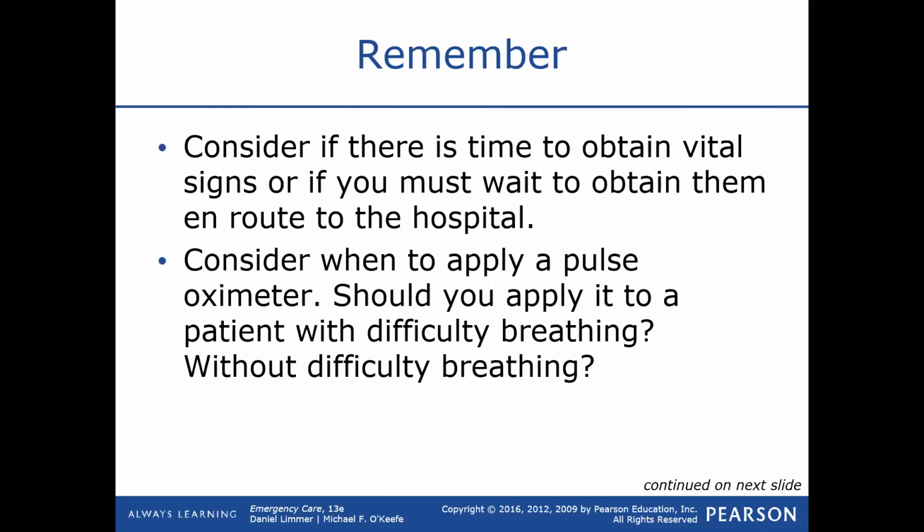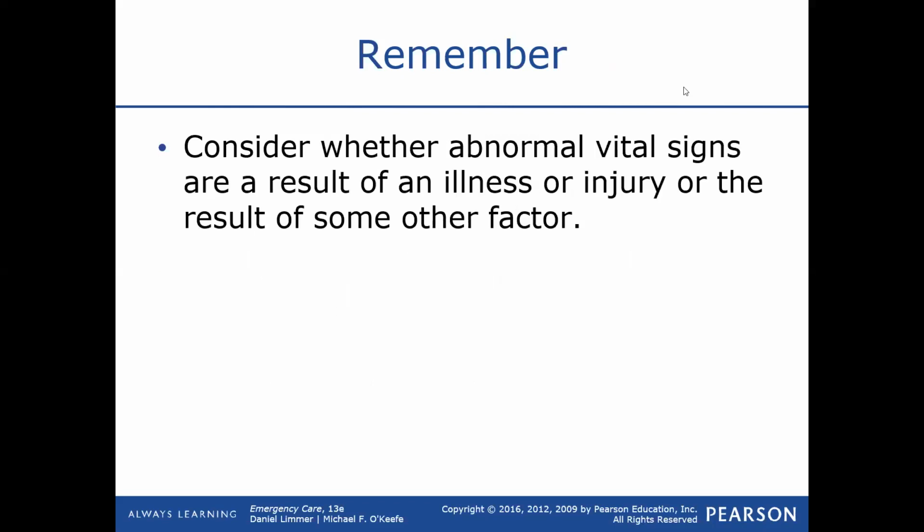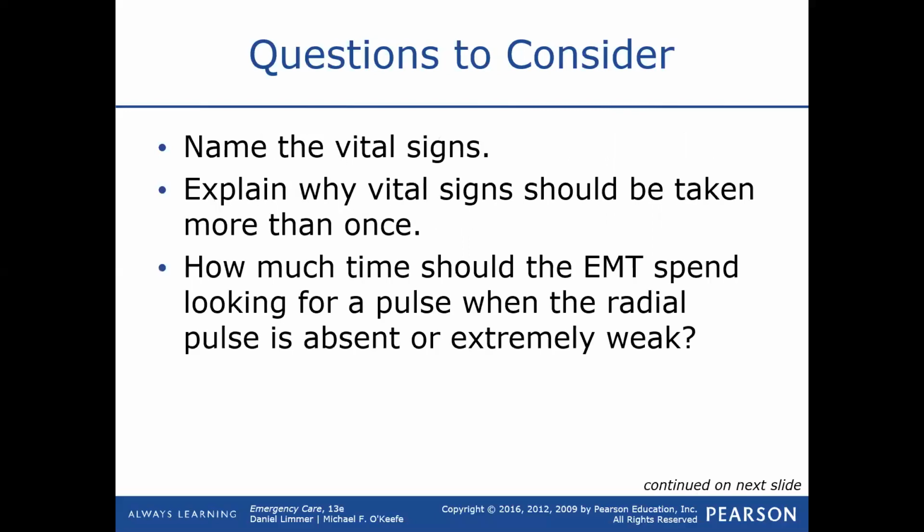Consider when to use a pulse oximeter. Should you apply it to a patient with difficulty breathing or without difficulty breathing? I would say yes. It's kind of a simple question. It's a non-invasive tool that we have. Just stick it on their finger, stick it on everybody's finger. It doesn't hurt. All right. Consider whether abnormal vital signs are a result of an injury or an illness or some type of factor.